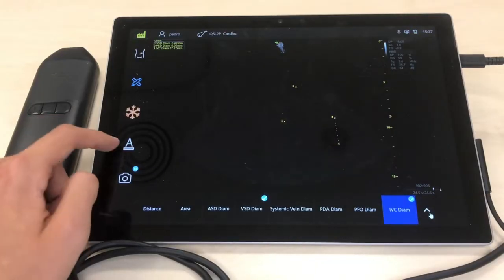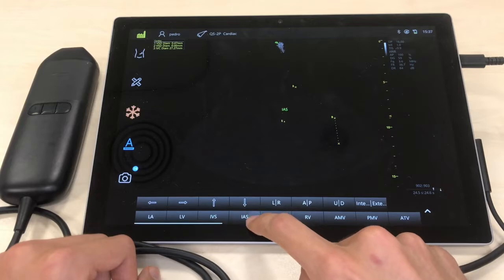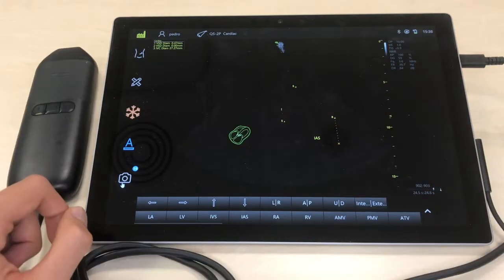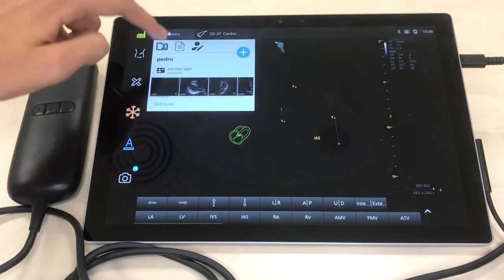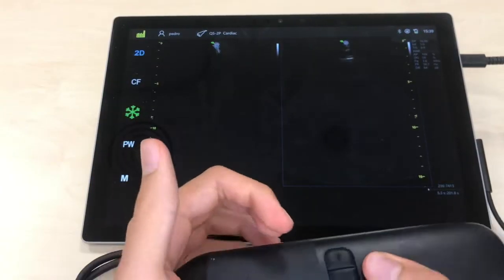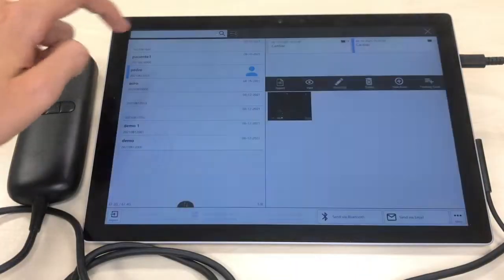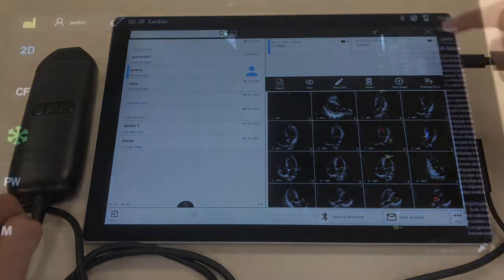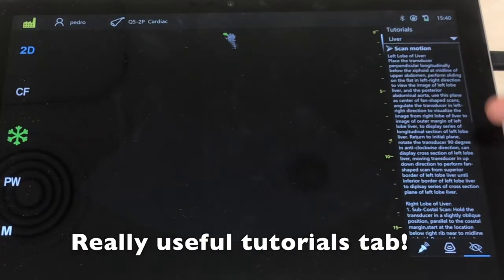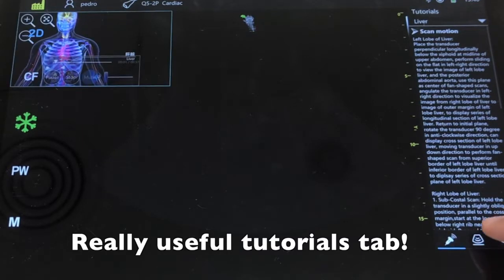We can also put some text tags over the image in case you want to save them for a future presentation, article, congress, or whatever. On the top bar we can choose from prior patient studies and display a past image on the left half of the screen while watching the live image on the right half, in case we want to compare them to assess any improvement or worsening. This makes more sense for musculoskeletal static images rather than cardiology live videos. The images saved can also be shared through a variety of options.